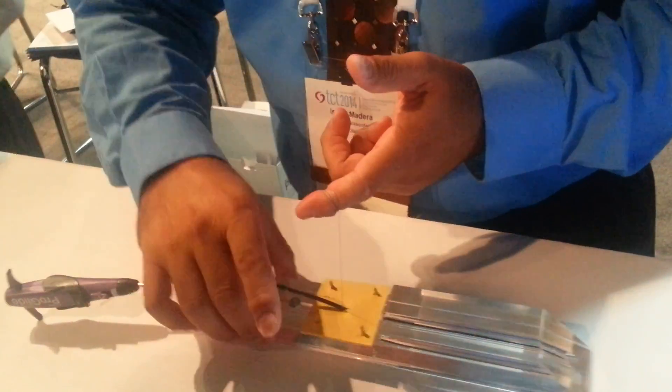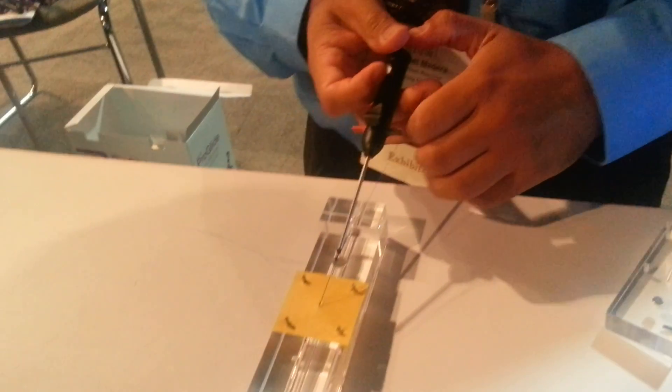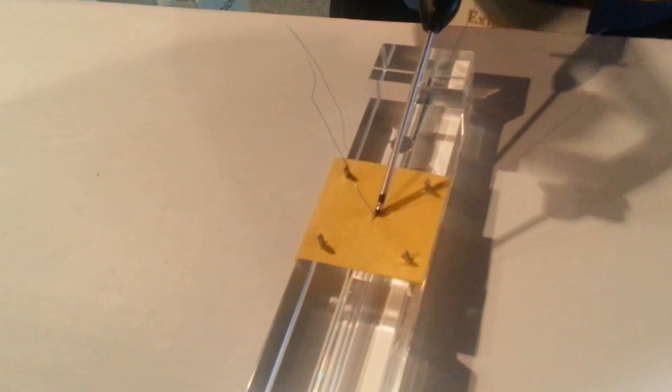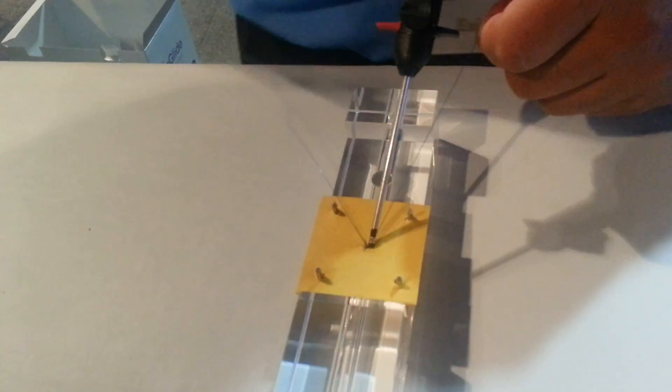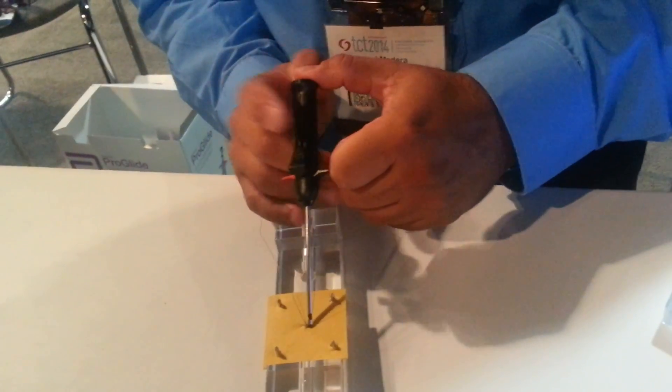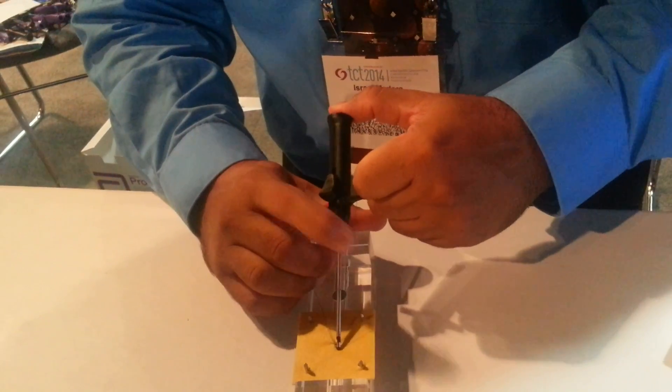Left hand. I'm moving the knot down. I'm going to go coaxial, I'm going to open this, I'm going to drop it right here. All I'm doing — you guys can see — I'm moving the knot down, that's all I did. Now I'm going to pull on this — not push, pull.